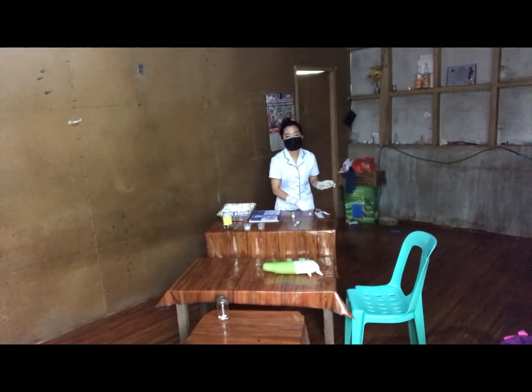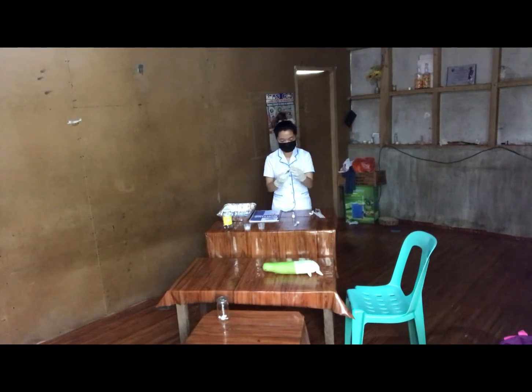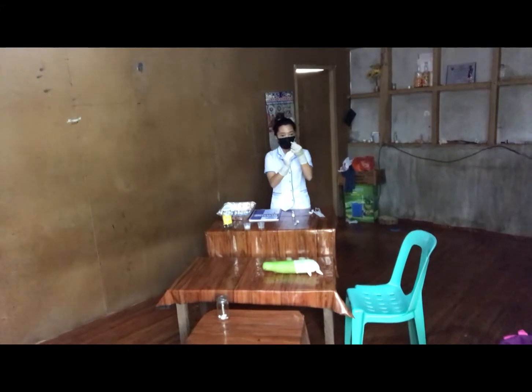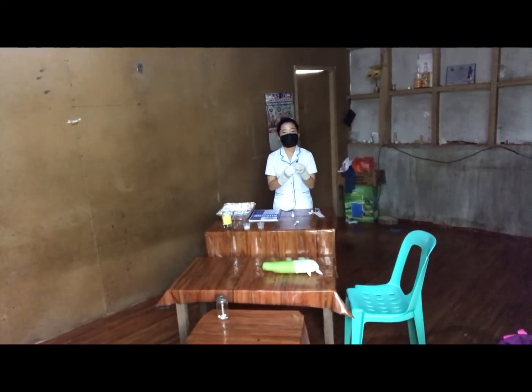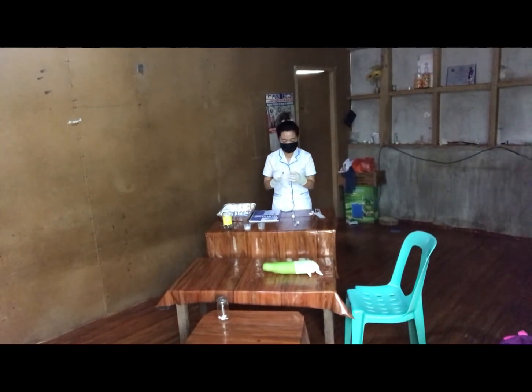Now take the syringe and cuff the syringe and draw some air inside the syringe. Then after that, inject the air into the vial.